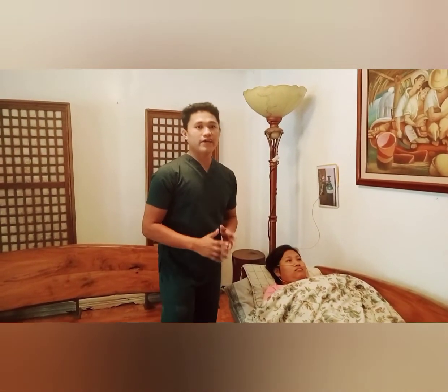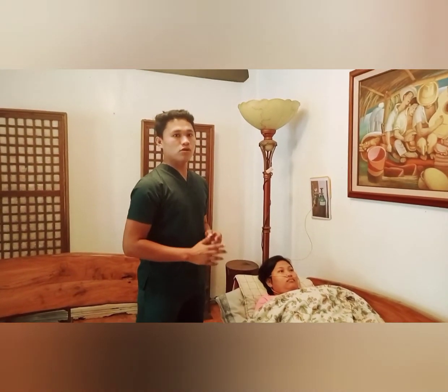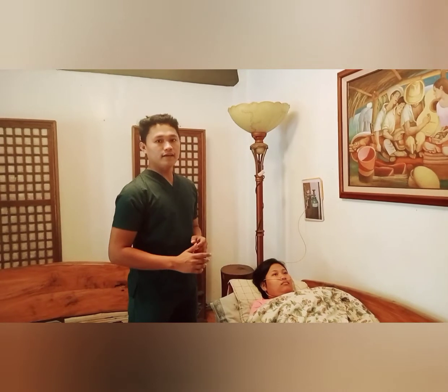Proper position allows unobstructed oxygen flow and ease of client respiration. It also maintains sufficient slack in the oxygen tubing to prevent the tubing from getting out of place accidentally. We also encourage the client to breathe in through the nose rather than the mouth, then exhale through the mouth, because breathing through the nose inhales more oxygen than through the trachea.